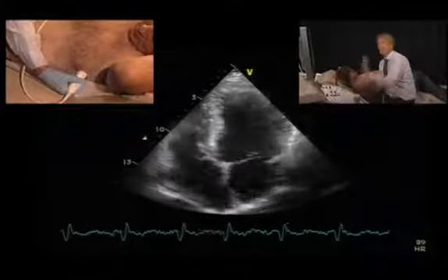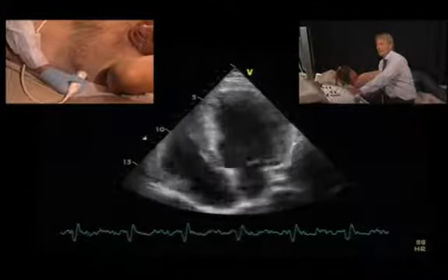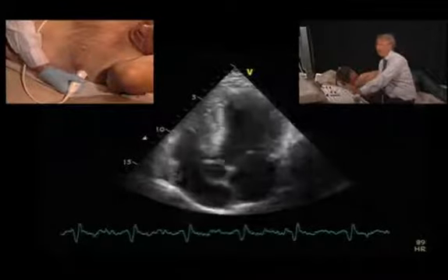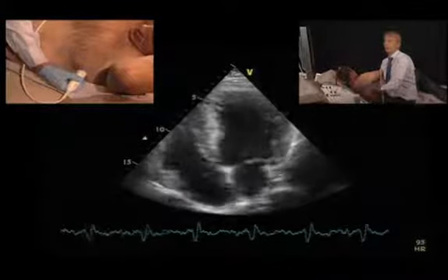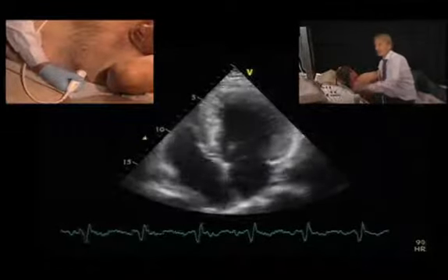But there's also other ways of looking at this patient, at his diastolic function. Just by purely looking at the 2D image, you can recognize that the patient has severe left ventricular hypertrophy, he has hypertrophic cardiomyopathy, and such patients just cannot have normal diastolic function. So clearly, all you would need to have is the 2D image. And there's another way of looking at it.